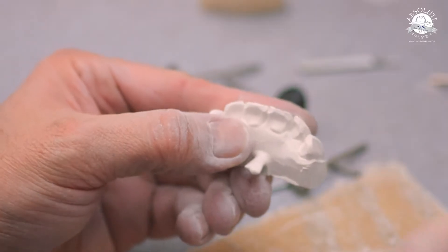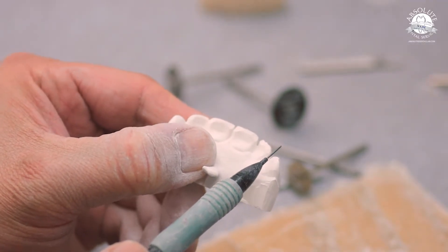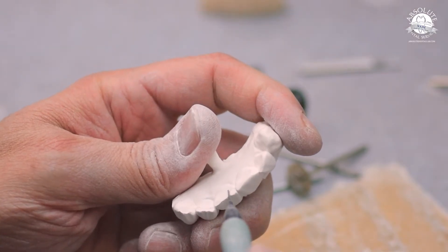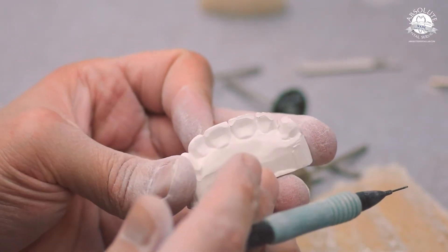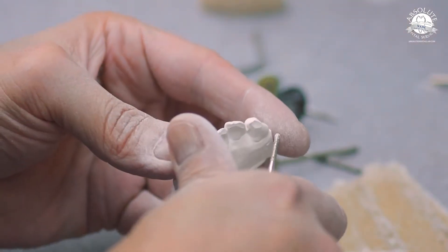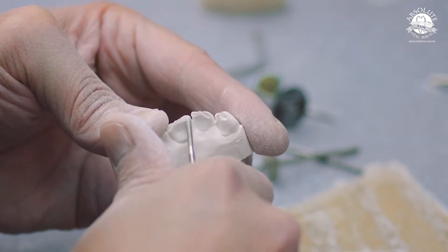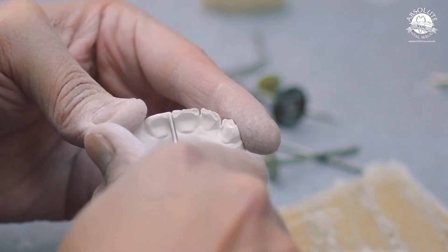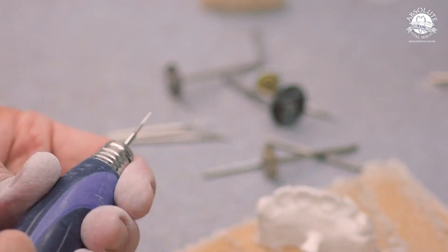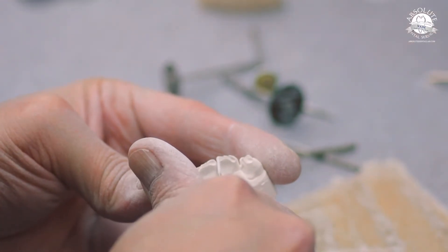I like to use a black pencil to mark the highest point of the incisor ledge — that way when I wear down my incisor ledges, I know I'm not shortening them. As long as the black pencil remains, I have not shortened that edge. For the wear facet, you push the diamond in and peel it straight up — that gives you that teardrop shape that is commonly seen with wear facets.